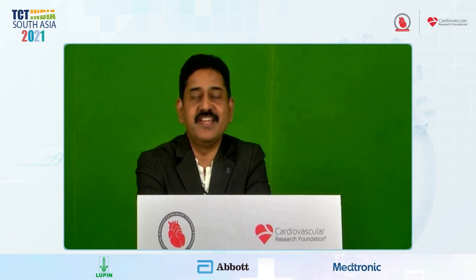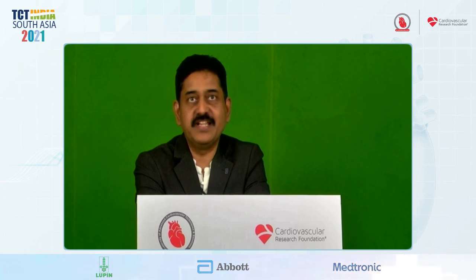Thank you, sir. But the only problem with this technology, neither with CT or with this, is you need to get a good angiogram first. If your angiographic clarity is bad, cath lab images are not good, then you can't help it. Similarly, the CT. Obviously, you can't expect good things when your quality of imaging is bad, but that is where there is a crux. I think this is a great technology where in future, I wish it should become part of every cath lab, so that what is right for the patient can be done, avoids unnecessary stenting, and it could become like a future QCA plus this modality that is the best for cath lab diagnostic modalities.